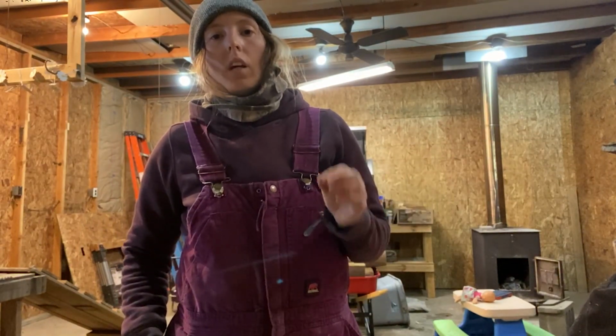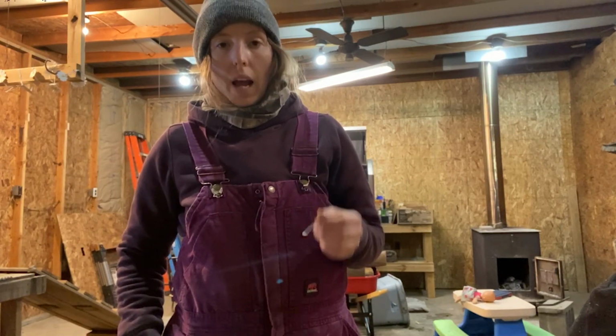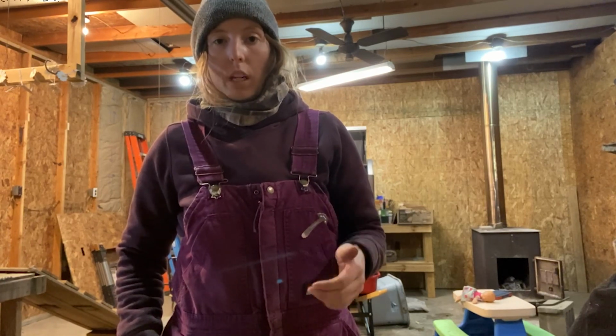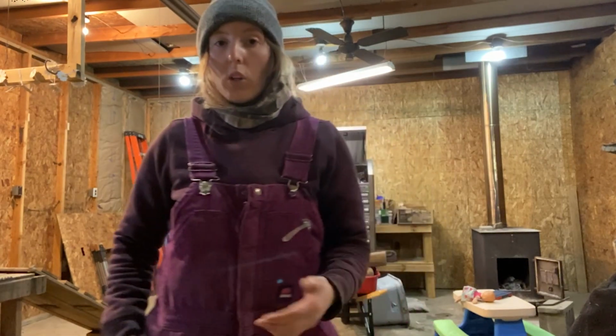So anyways, what do you need starting off if you want to draw blood on your goats? Well, you're going to need first to find out what lab you're sending off your samples to. And the reason why that is critical is every lab has different requirements about the volume of blood that they need from an animal to run certain tests.